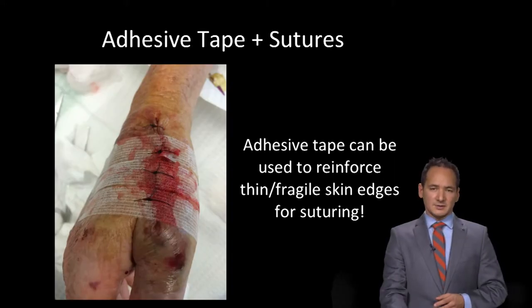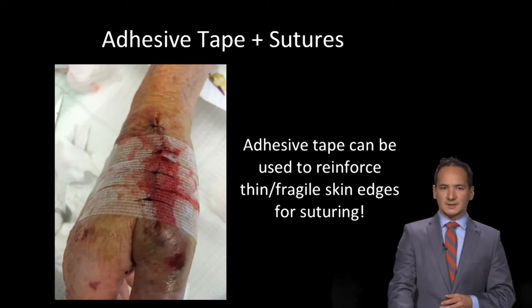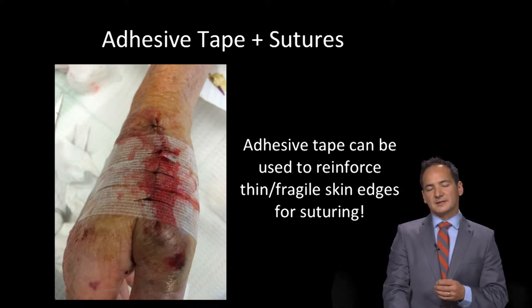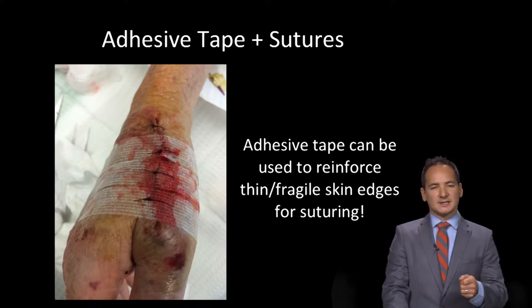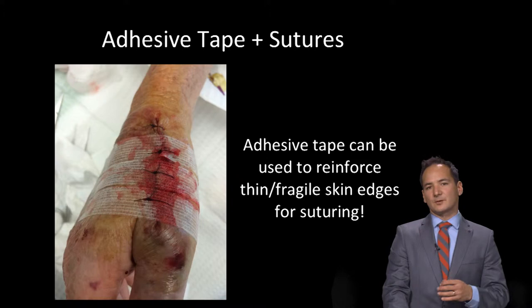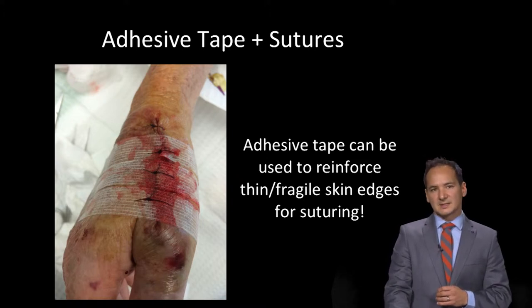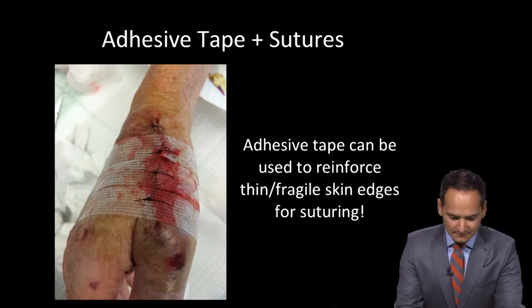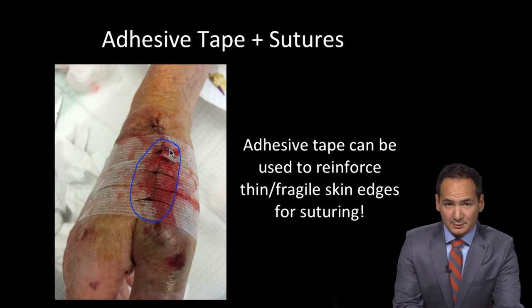Adhesive tapes can also be used in conjunction with sutures for certain wound types. For example, this patient was elderly with thin, frail skin. It would have been very difficult to place sutures through and through her skin, which was easily going to tear with just suturing alone. So what we did here was use adhesive tape placement first in order to reinforce those thin and fragile skin edges to allow it to more readily accept those sutures, which you're seeing right here in the center of the wound.